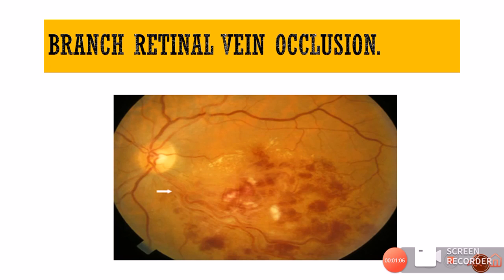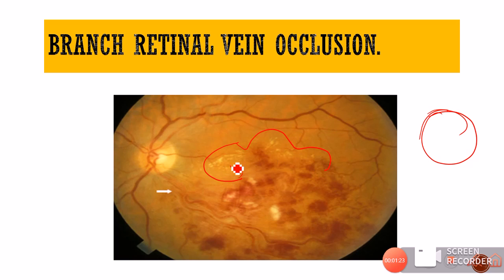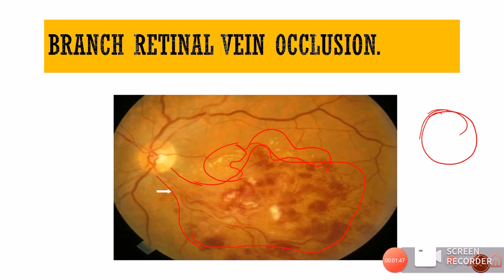In branch retinal vein occlusion (BRVO), hard exudates can also be present in a ring structure — either a complete or incomplete circinate ring. In this image the ring is incomplete because hemorrhages are blocking part of it. BRVO shows sectoral distribution: here the inferior arcade is involved, with exudates and hemorrhages all present inferiorly, indicating inferior temporal BRVO with macular edema.